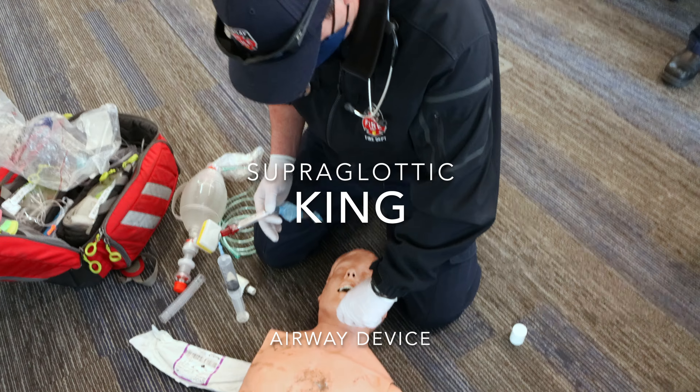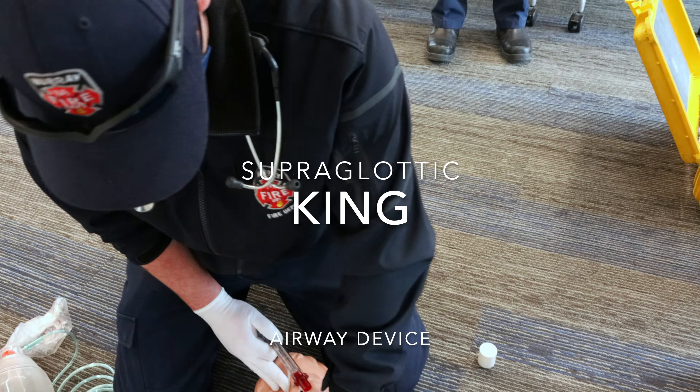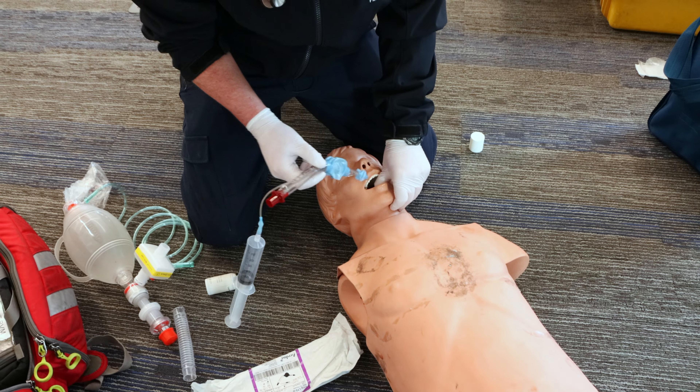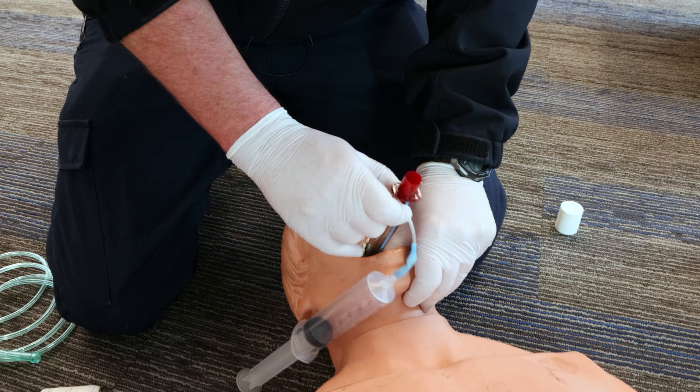It's an unresponsive adult. If you can just grab that lower mandible and tongue and pull it kind of towards the feet. Just drop your tube down in there as far as it'll go.